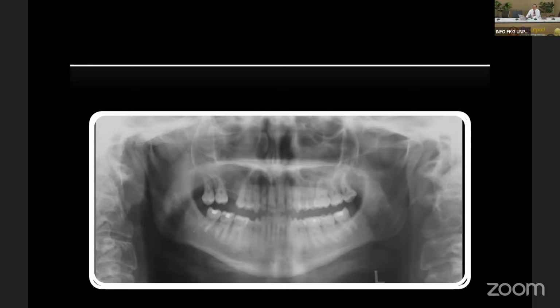If you have experience in radiology residency? Yes, if we look quickly at the panoramic radiograph, sometimes it's hard to see the change.